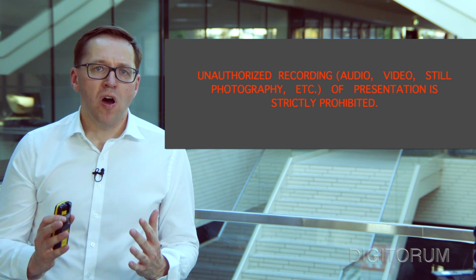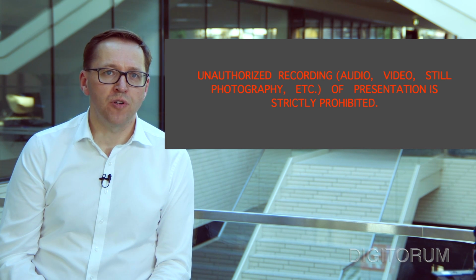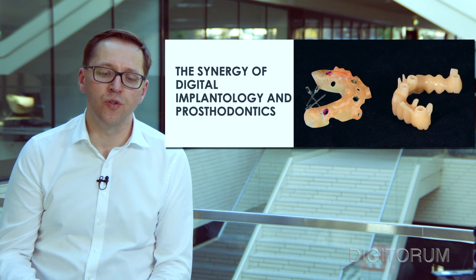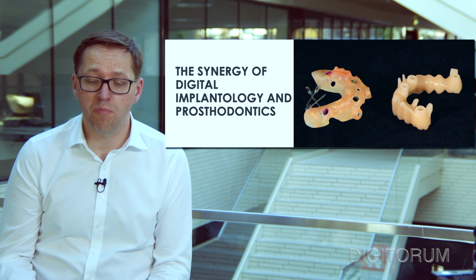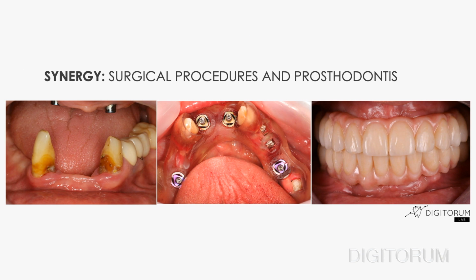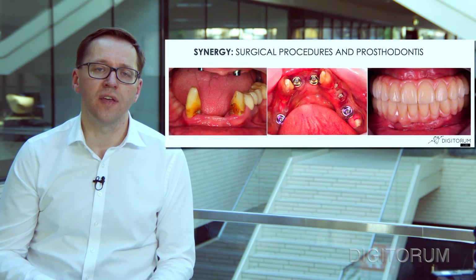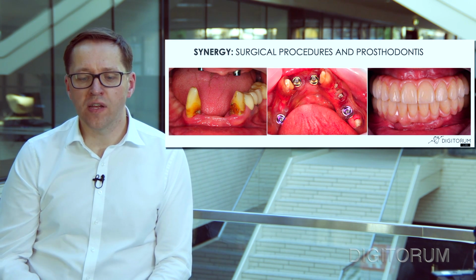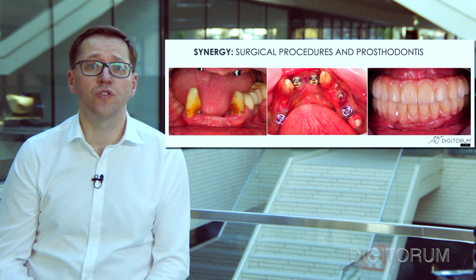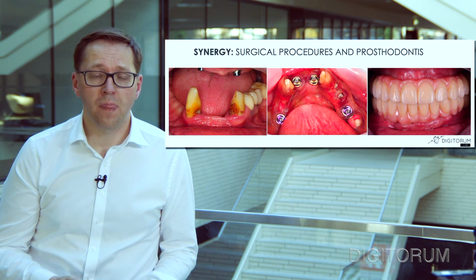Well, the most fascinating part of the digital workflow most probably is the synergy between the surgical techniques that can be planned using the digital tools and the digital prosthodontics. So we quite often apply this in cases like this, to go from really complicated situations in a well-planned way through fully guided surgery and complete the cases with restorations produced without any surprises. This is a great value for us.